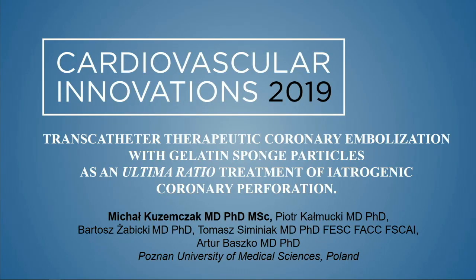Thank you for the invitation and for giving me the opportunity to present our case report. The case report I would like to present is titled Transcatheter Therapeutic Coronary Embolization with Gelatin Sponge Particles as an ultima ratio treatment for iatrogenic coronary perforation.